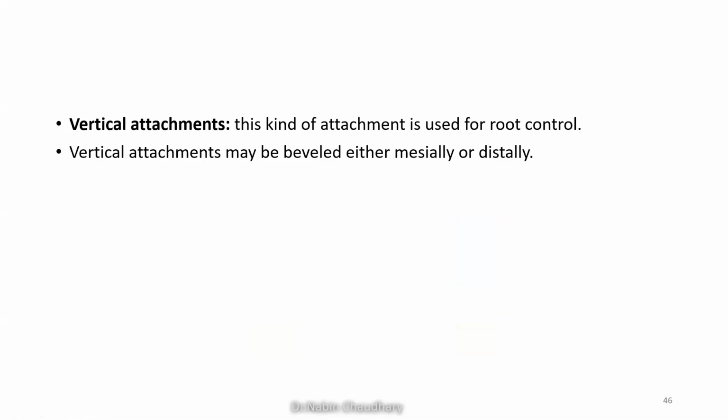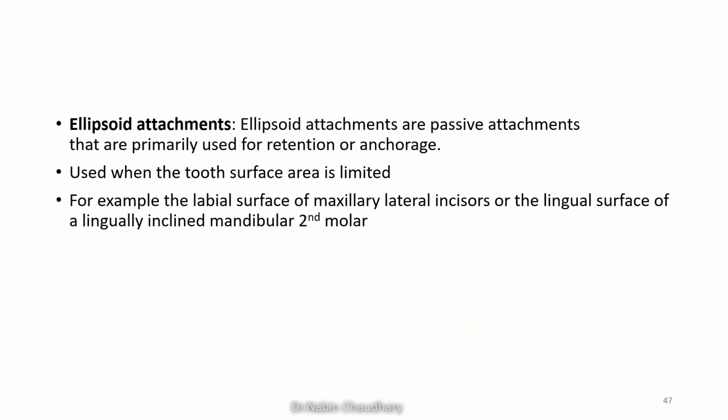And there is also the vertical conventional attachment, and this type of attachment is generally used for root control, and it can be beveled mesially or distally in order to perform the desired tooth movement.